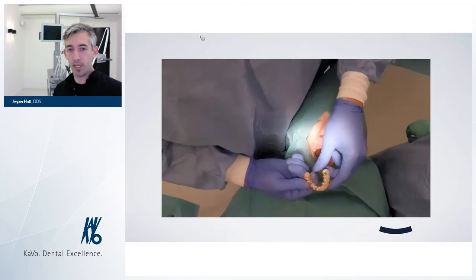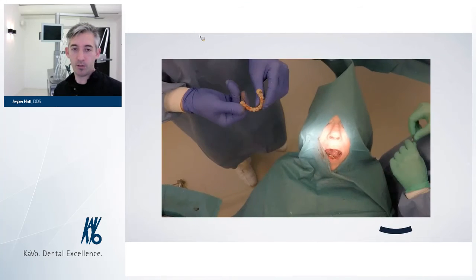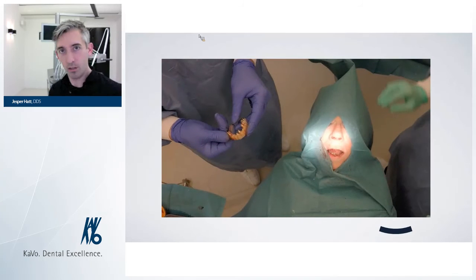And now it goes to our in-house lab. It's just a regular small lab, because now we have to make sure that everything is adjusted. There has to be some composite put up around the temporary abutments, to shape the soft tissue the way we want it, and make sure that everything is easy to clean and keep for the patient.